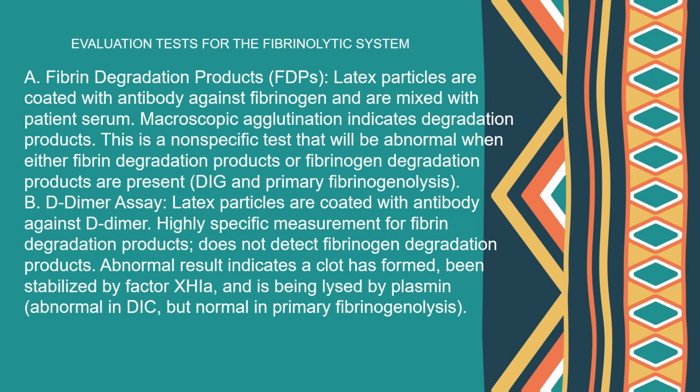of degradation products. However, this is a non-specific test, and that can lead to abnormal results when the products of degradation are present. For example, in cases of DIC and primary fibrinogenolysis.